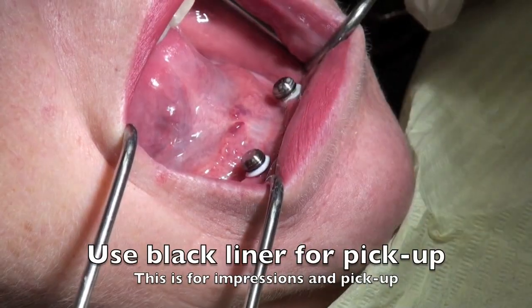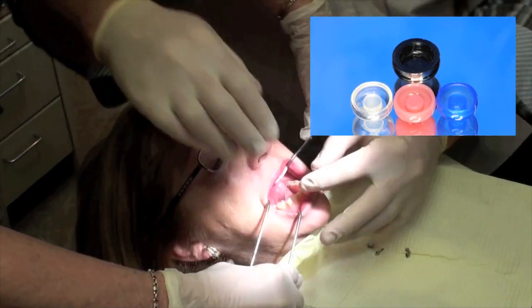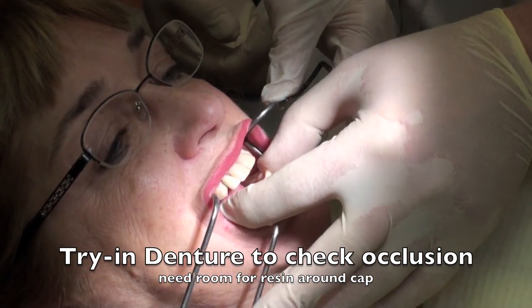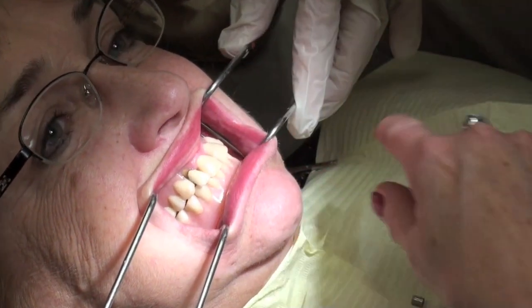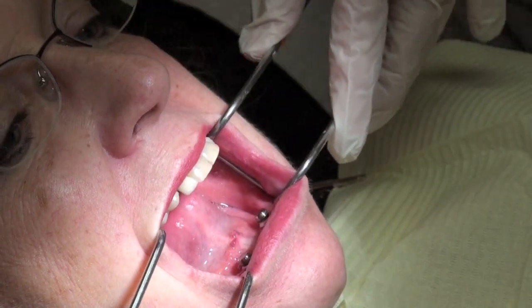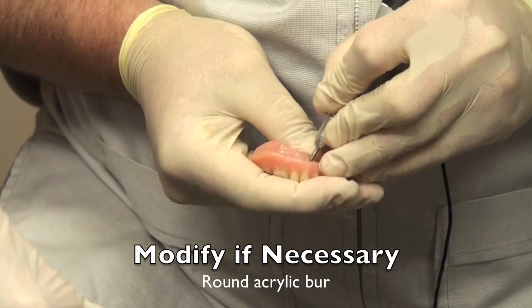Once this is put on, it sits about a millimeter above the tissue — this would be the ideal position for the locator attachment. We'll be able to change the attachment to a different color later, but we're going to use black for the impression. It is important to try the denture back in again over these metal housings to make sure there's enough space for everything plus the resin, so we're not fumbling around during pickup. If modification is needed, we can do that prior to the pickup impression technique.